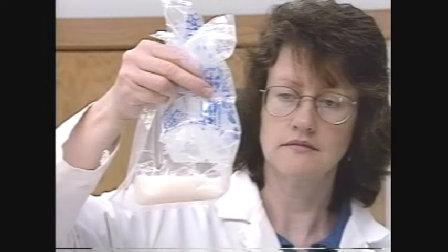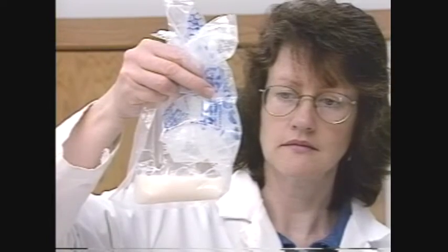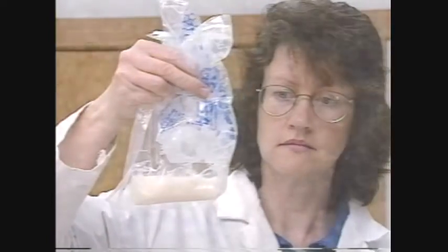The first method is a visual estimate of concentration based upon color of the ejaculate. This method provides only a crude idea at best of the concentration and only allows you to make a guess as to how far to extend the semen.